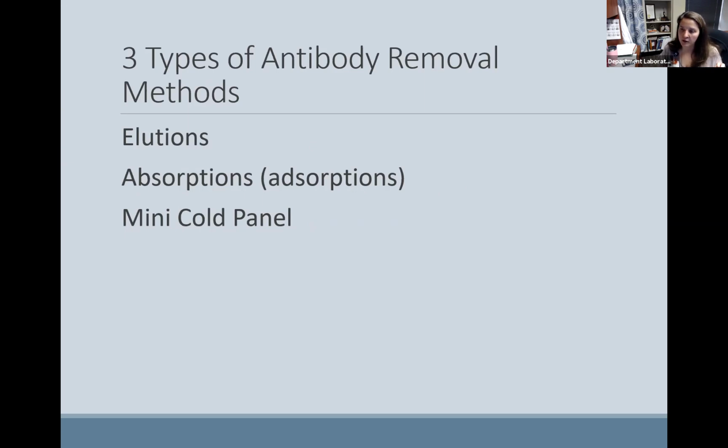If you remove that antibody, then the DAT will be negative, so you can repeat that DAT, and then you can obtain a patient phenotype, or you can do a true weak D interpretation.